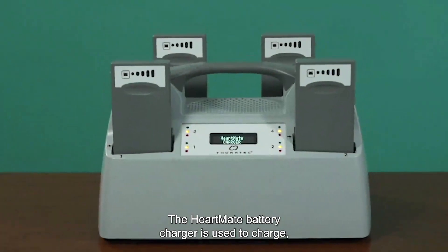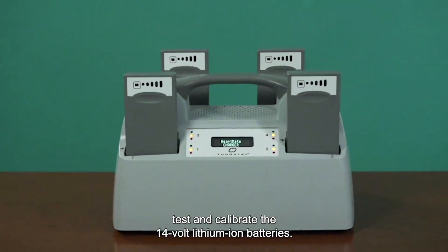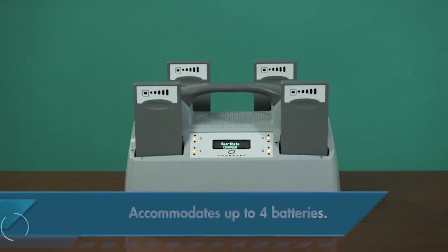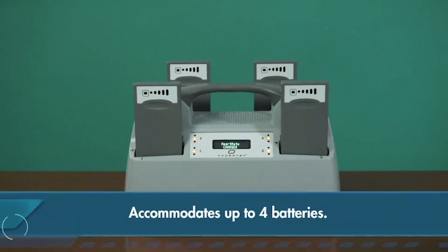The HeartMate battery charger is used to charge, test, and calibrate the 14-volt lithium-ion batteries. As previously mentioned, the charger can accommodate up to four batteries at one time.